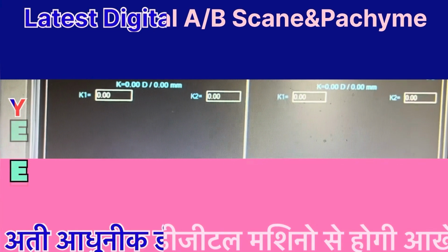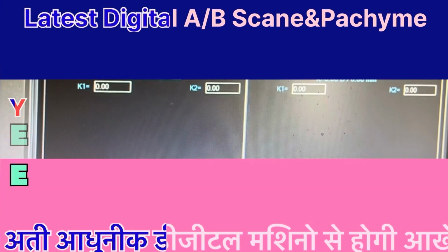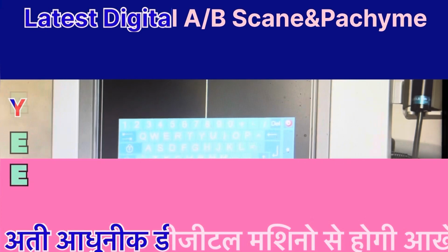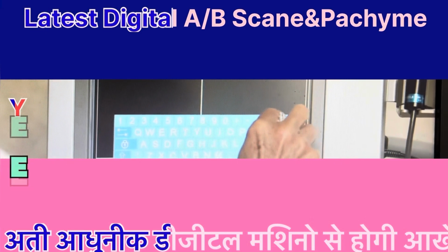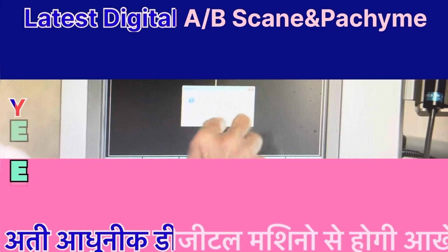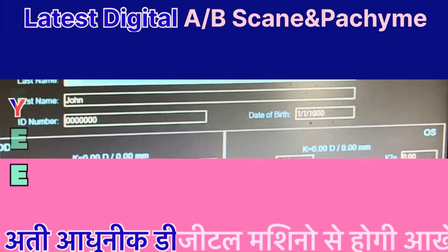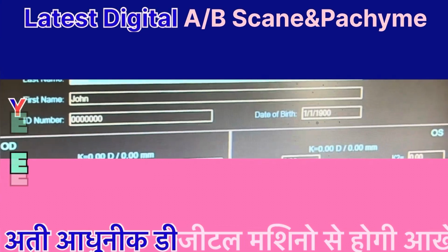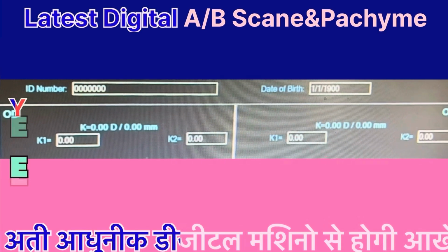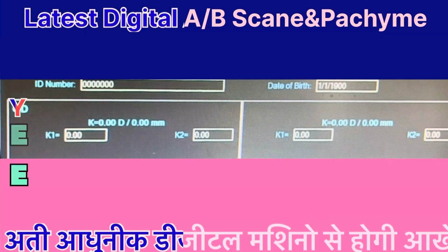After selecting or setting up a physician, find or add a patient via the Patient File icon at the bottom of the screen. A returning patient's record can be found by typing the first letter of the patient's last name in the last name field. A list of all existing patients can be viewed by typing a star or % sign into this field. To create a new patient record, the examiner can enter details into the empty fields and select the Save icon at the bottom of the screen.